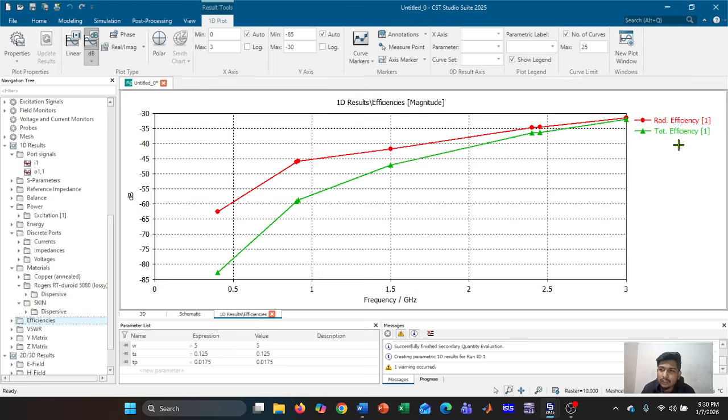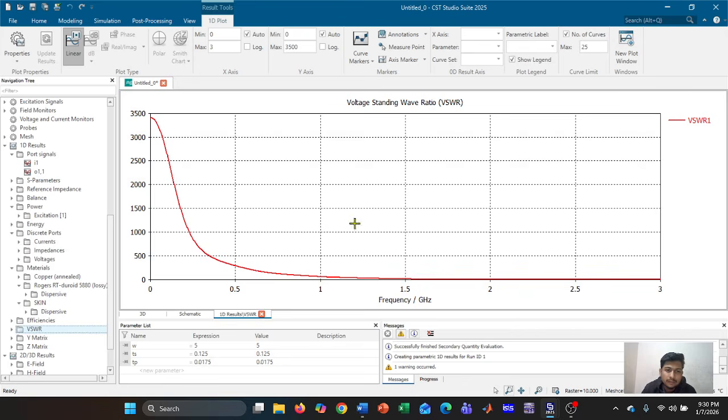This graph shows how efficient the antenna is. The efficiency is very low. It is not a problem. Implant antennas always have low efficiency because the body absorbs energy. This is the VSWR curve. This graph is another way to show impedance matching. You can see VSWR is high because the antenna is implanted. For implant antennas, the S parameter is more important than VSWR.